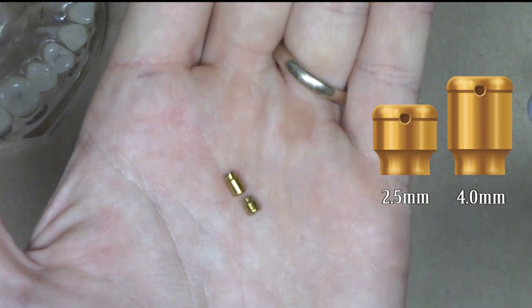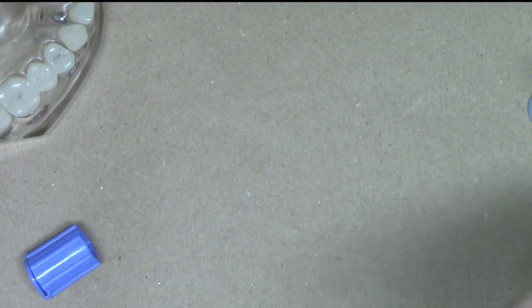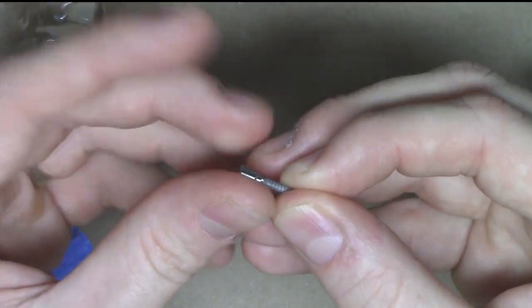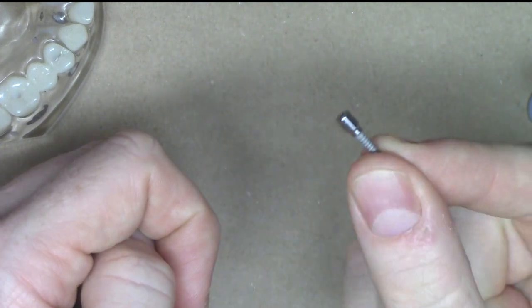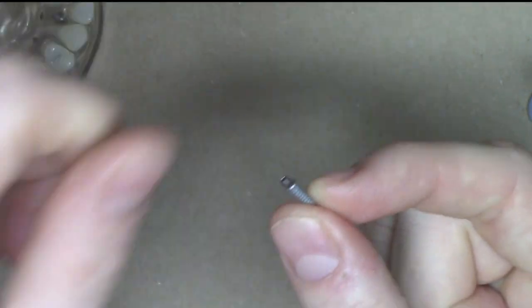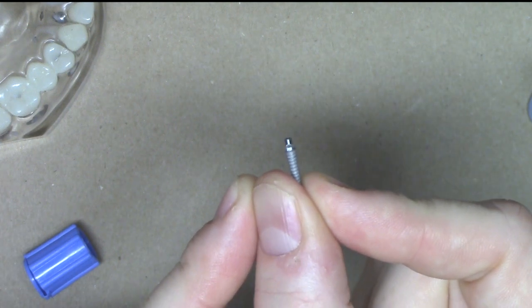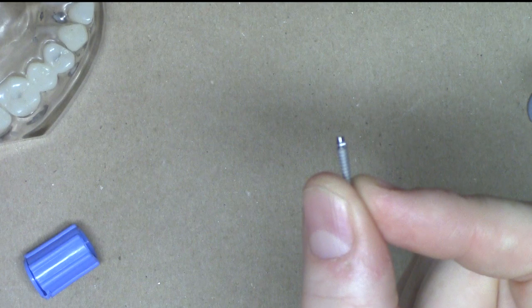Two different cuff heights. But also, similar to what you just saw with that existing standard diameter implant, we also have some healing abutment parts like you've seen on other clinical videos. But what you don't see is we don't have any cover screws because this implant is meant for transgingival healing or a one-stage surgical protocol.